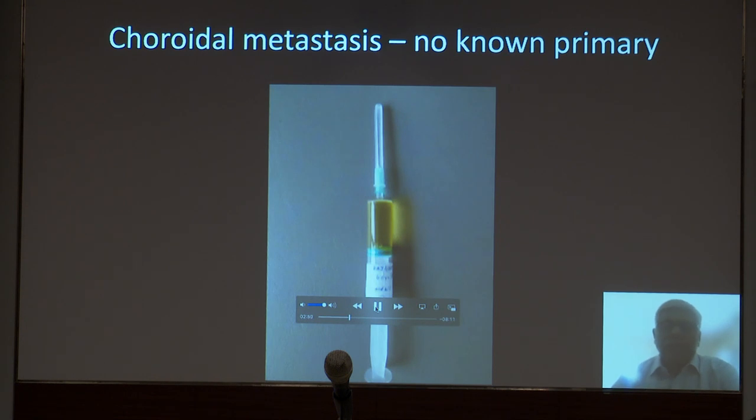Once the needle tip is inside the mass lesion, the assistant exerts suction onto the syringe, and considering that the mass is a solid lesion, no tissue or fluid can be seen traversing the tubing. So the syringe is sucked out and kept, the suction is retained for about a minute, and then the plunger is released slowly. Whatever little sliver of tissue is there in the needle is the one which is obtained for a biopsy.